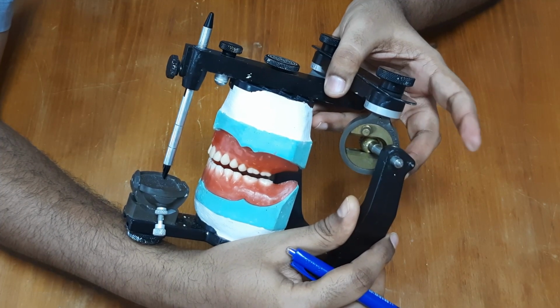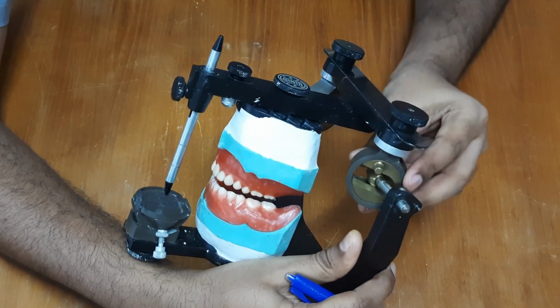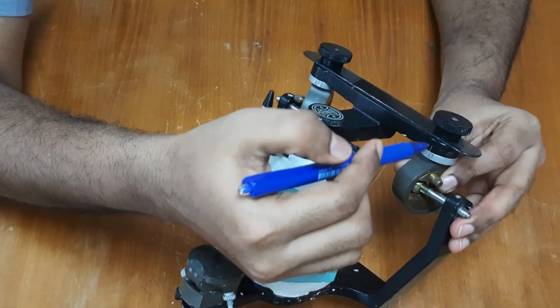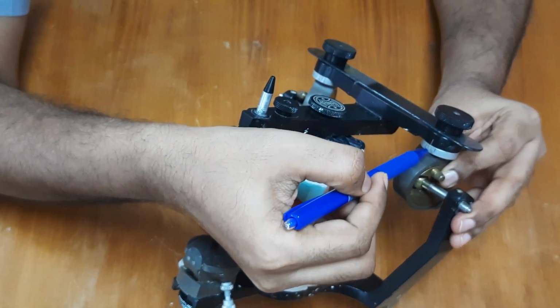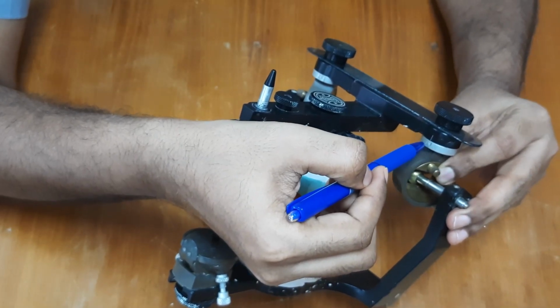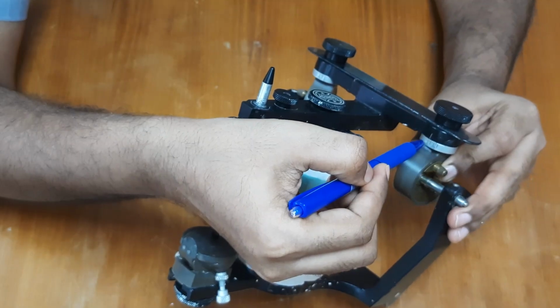The condylar guidance can be rotated around the vertical axis like this, and this is the calibration for the Bennett angle from 0 to 30.